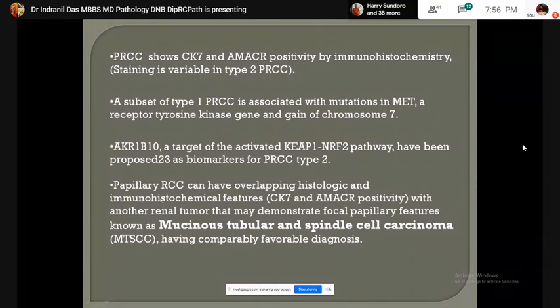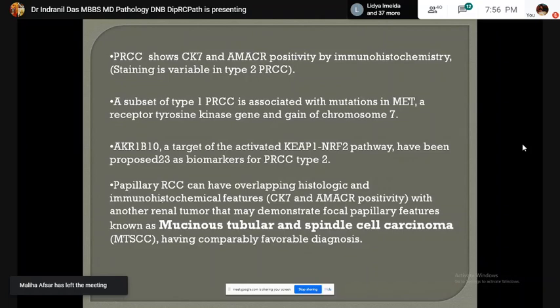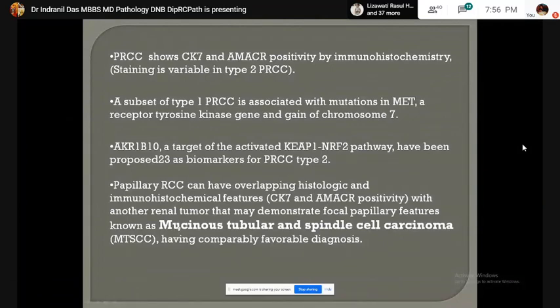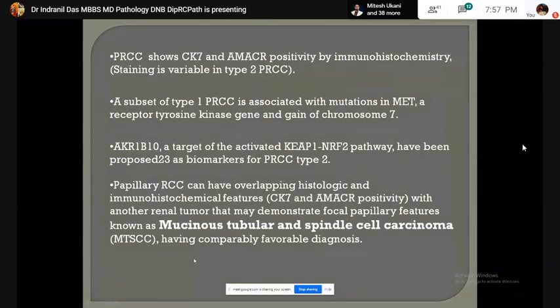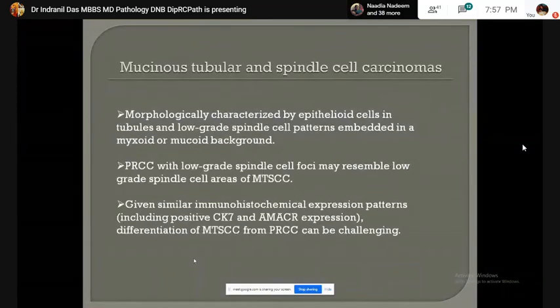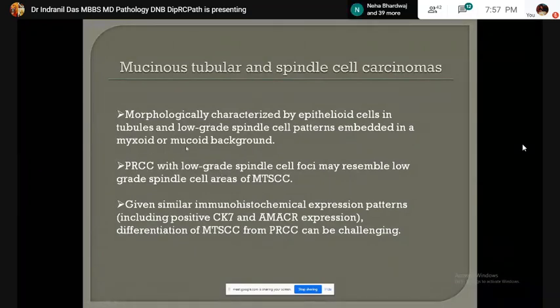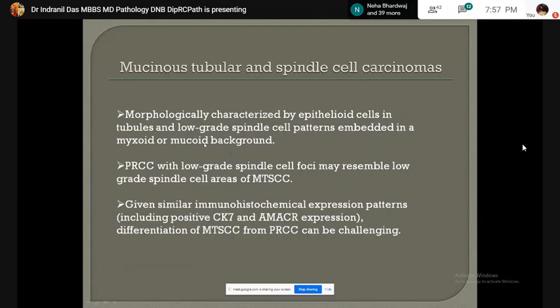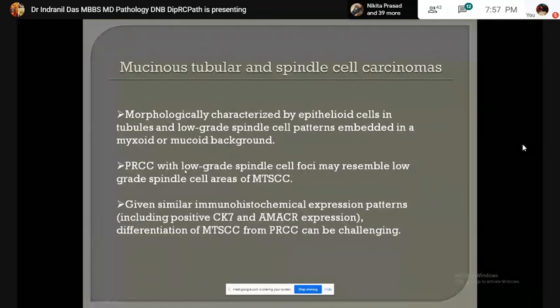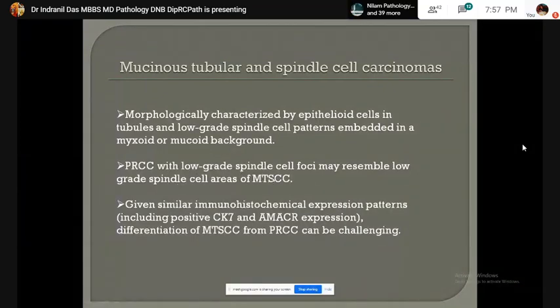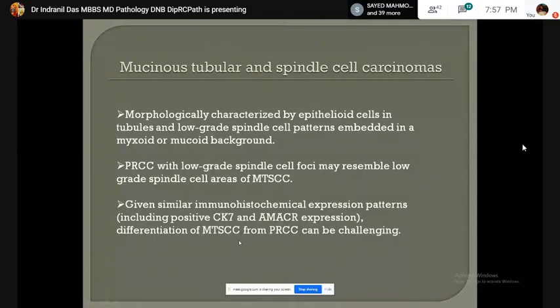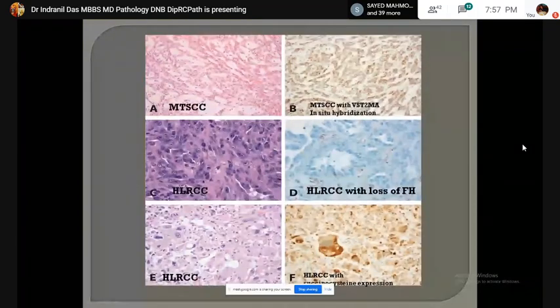Papillary RCC has overlapping histological and immunohistochemical features with mucinous tubular and spindle cell carcinoma (MTSCC), but MTSCC has a more favorable prognosis than papillary RCC type 2. MTSCC is morphologically characterized by epithelioid cells in tubules and a low-grade spindle cell pattern embedded in a myxoid or mucoid background. The immunohistochemical profile is similar — this tumor also gives a positive reaction with CK7 and AMACR.